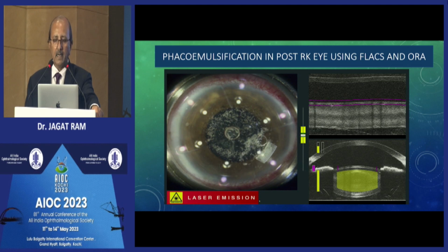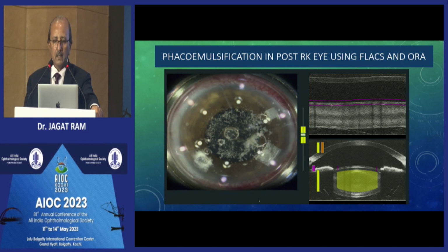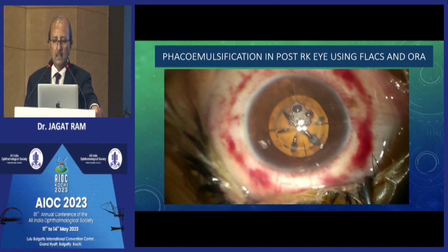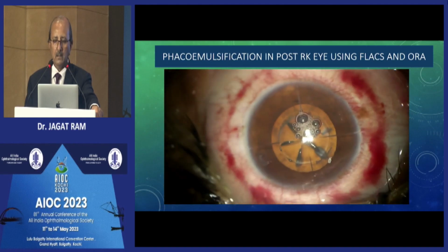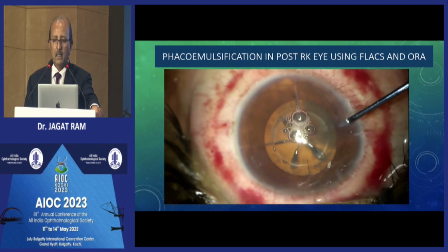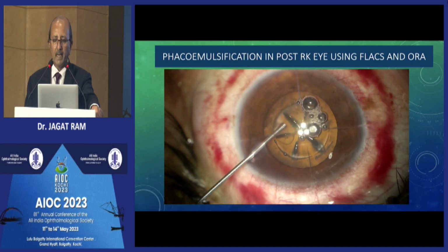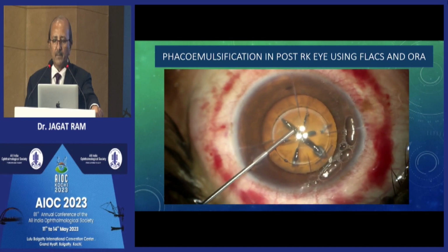Main incision and side port incisions, depending upon where there is more space or where it is required. And then performing phacoemulsification in the eye.